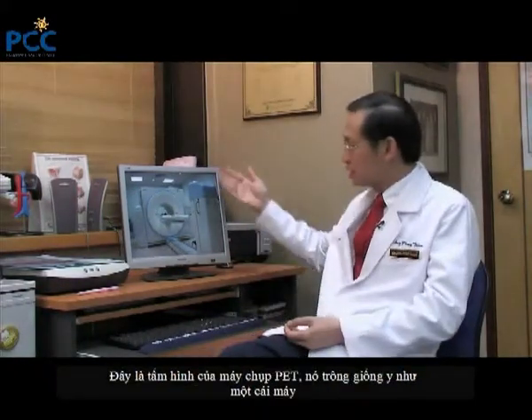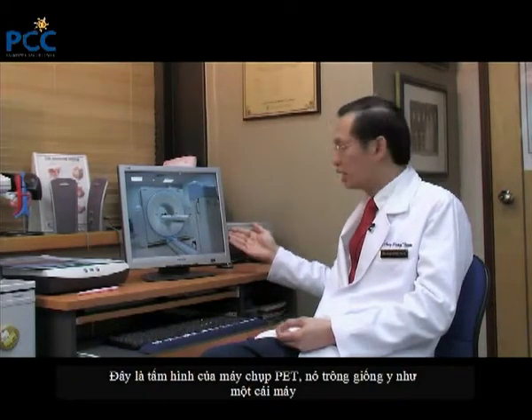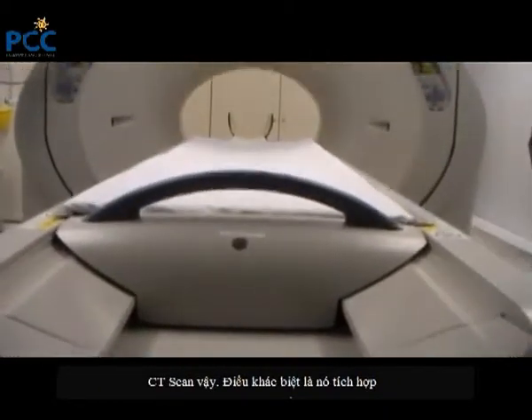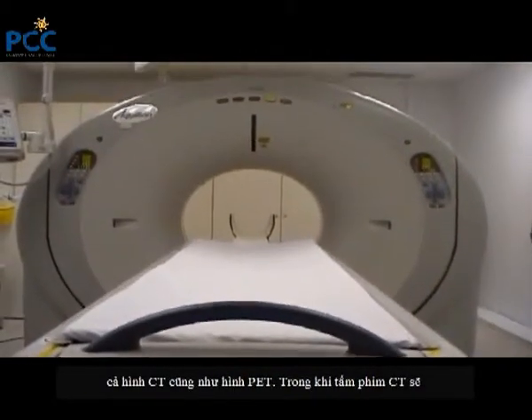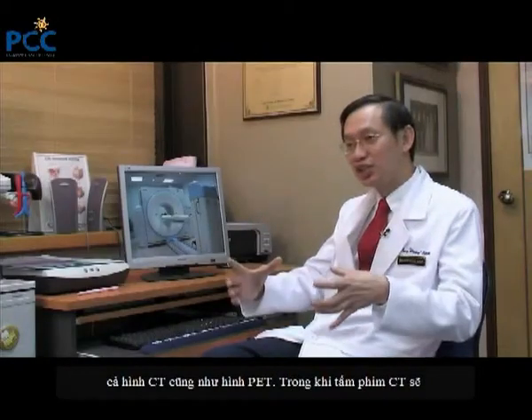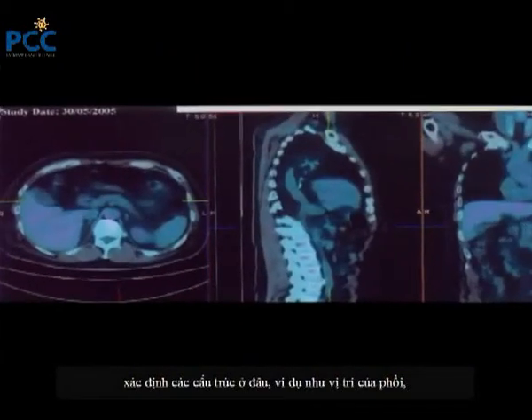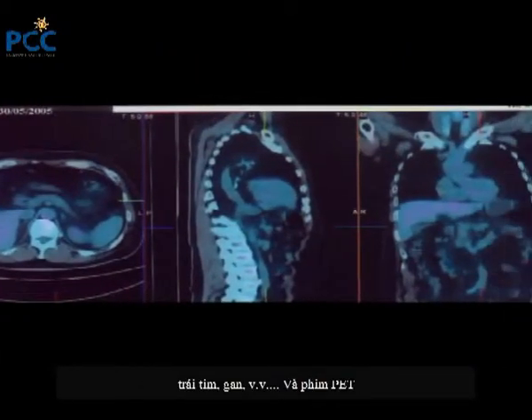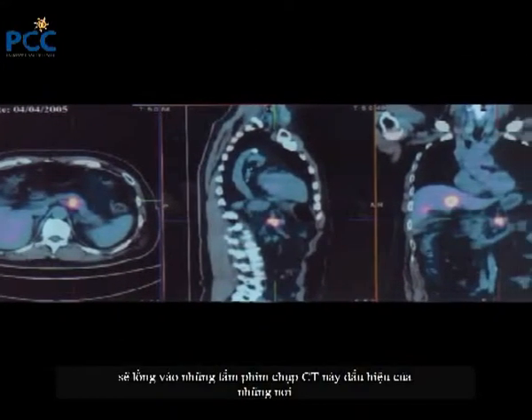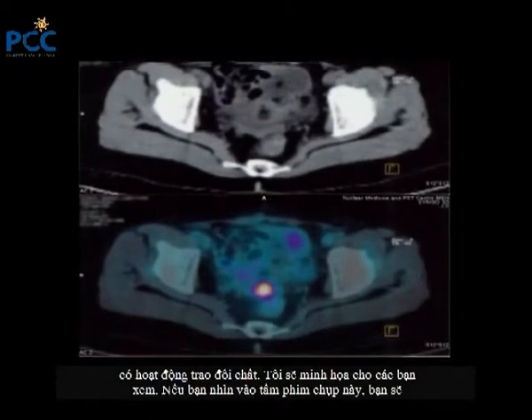This is a picture of a PET machine. Okay, it looks exactly like a CT scan machine. The only difference is that it compiles both the CT images as well as the PET images. And the CT images will show you the structures where they are, the lung, the heart, the liver, and so on. While the PET part of it will incorporate into the CT images any areas of metabolic activity.